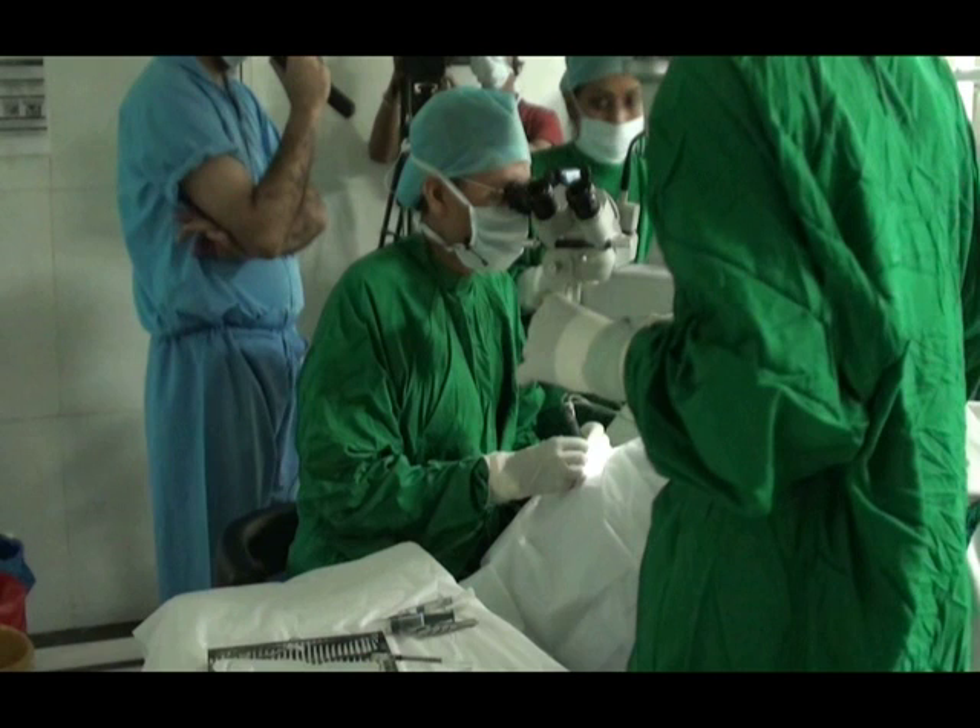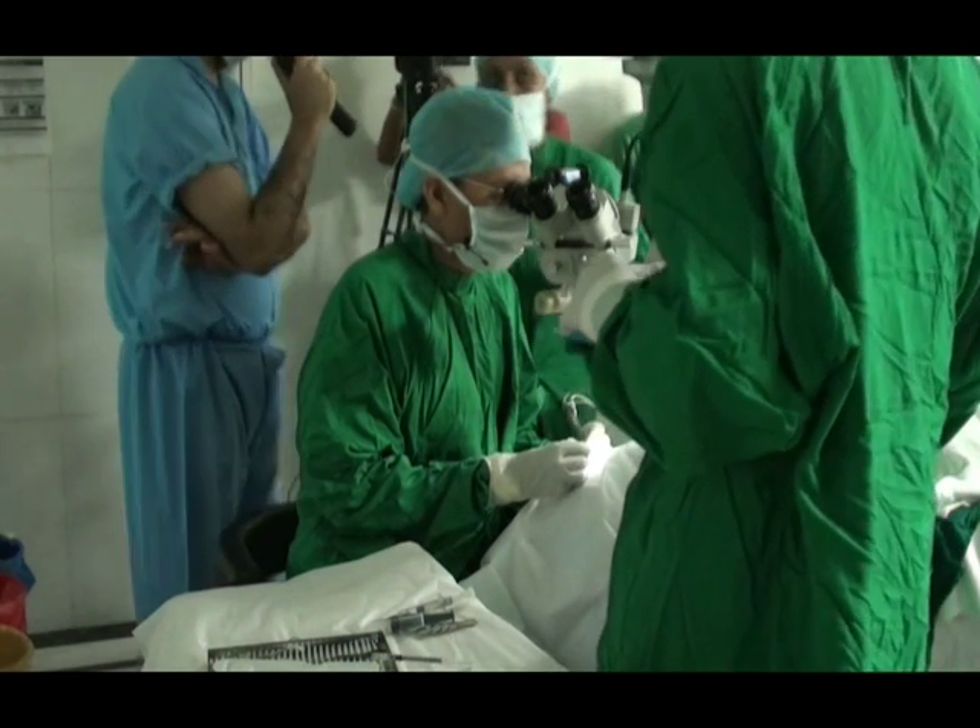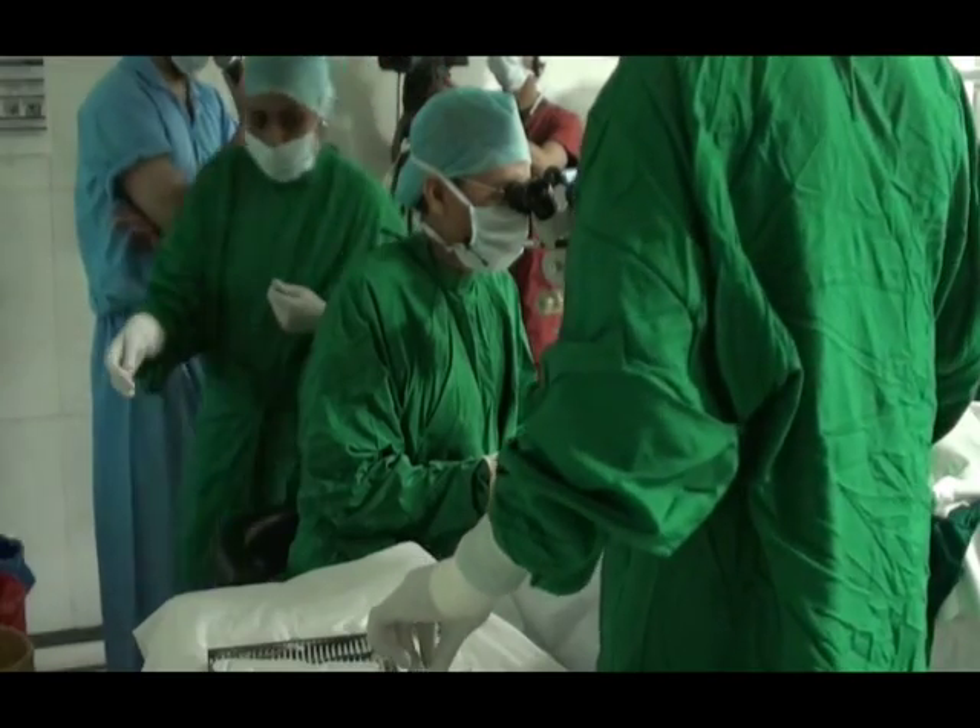The beauty of this machine is that even with a 90-degree needle, you can go up to vacuums of 500–550 with a good high aspiration rate, and the chamber is rock solid. This half piece is almost out. I am going to rotate the other hemi-nucleus and do the same thing.